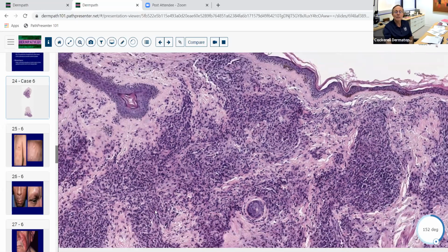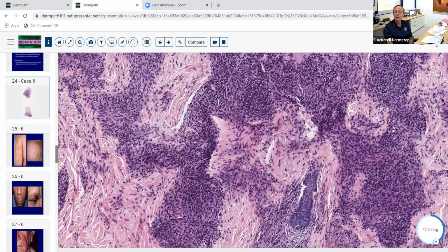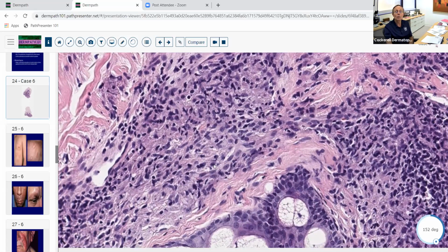And notice that it's kind of following these little neurovascular bundles here. In some areas, you've got histiocytes that predominate. Whenever there are zones where histiocytes predominate, or they're present predominantly, that means that it's at least focally granulomatous inflammation. Okay, we all know that there are 5 main types of granulomatous inflammation. So this one would probably be closest to either maybe sarcoidal or tuberculoid.